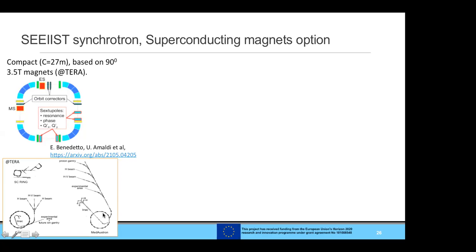As the professor was already saying in the previous talk, at CNAO they already made a big effort to be as compact as possible. You see that the LINAC was put inside the synchrotron to save space. This is the synchrotron, which is large, and the beam lines have also been designed for compactness. MedAustron is large because they believed it was better to keep space available for different options. But you see the clear reduction in dimensions if superconducting technology is applied.